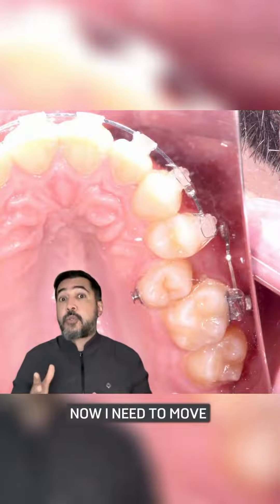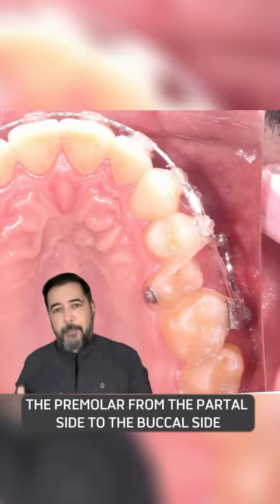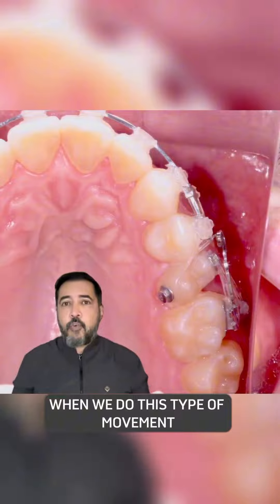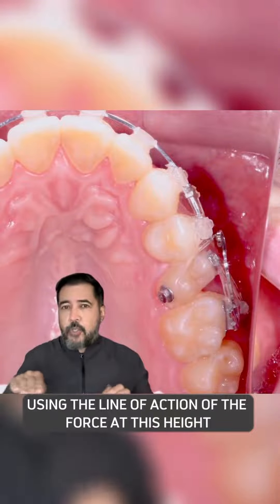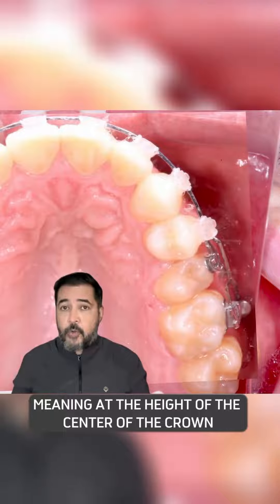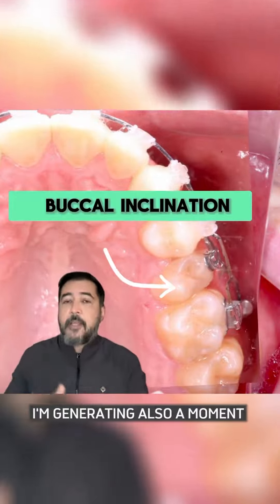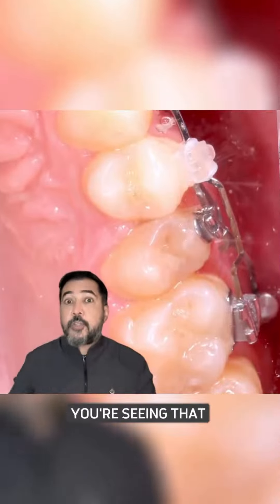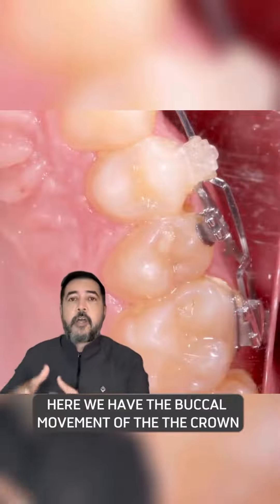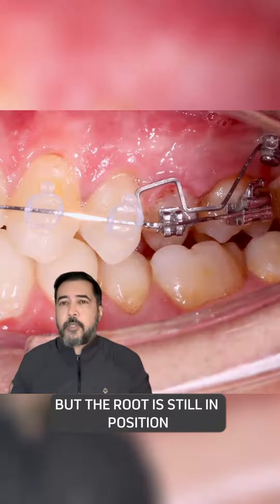Now I need to move the premolar from the palatal side to the buccal side, and there is a problem. When we do this type of movement, using the line of action of the force at the height of the center of the crown, I'm also generating a moment. So you can see that we have the buccal movement of the crown, but the root is still in position.